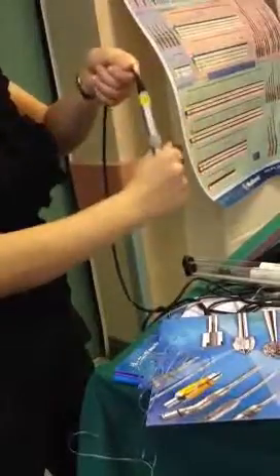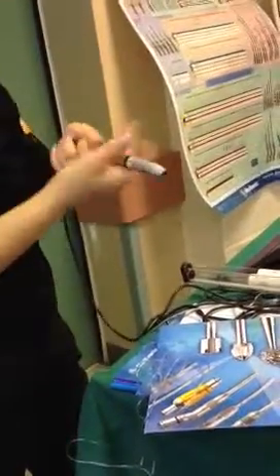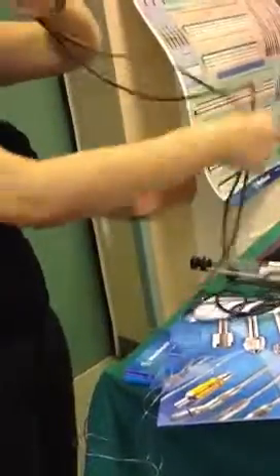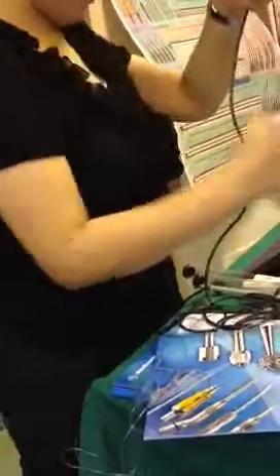Once it's done, use things to clean it and dry it. And for the cable, if there is blood and everything, you can hold these two and wash this one in the basin, and then wipe it down. Clear? For the attachment, no problem, you can run it with water, but for this one you have to cover it or wipe it down.